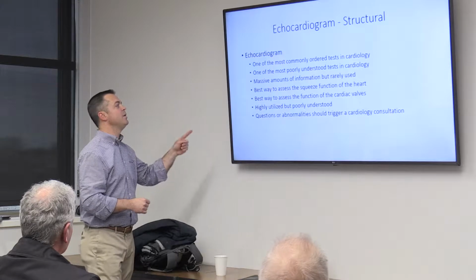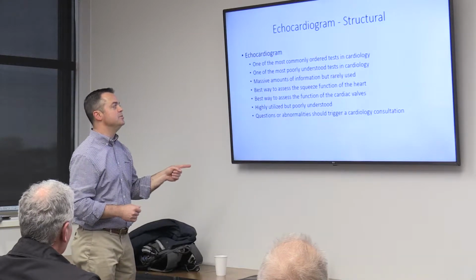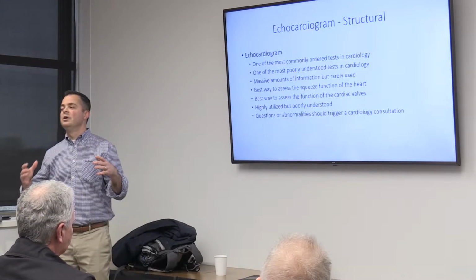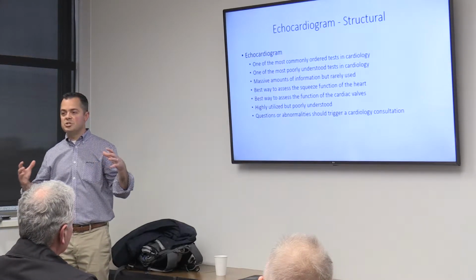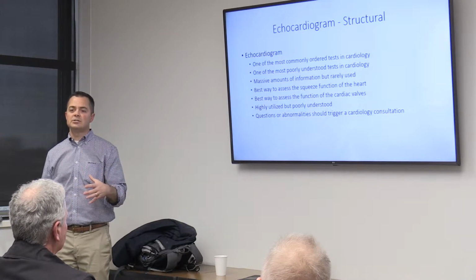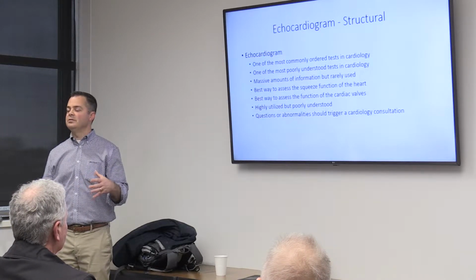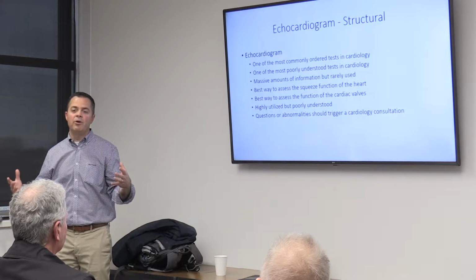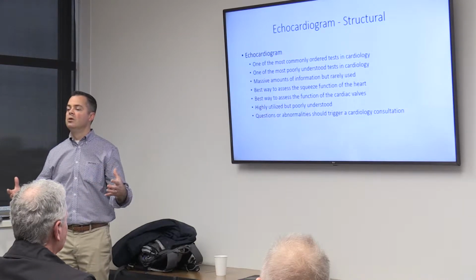Like I said, massive amounts of information, but rarely used. It is by far the best way to look at it. It is by far the most efficient and best way to look at the squeeze function of your heart. So we're looking at how well does your heart contract, okay? And some of you who've had heart disease may recognize something called the ejection fraction. That's a big ticket number that everybody will want to know from this test.